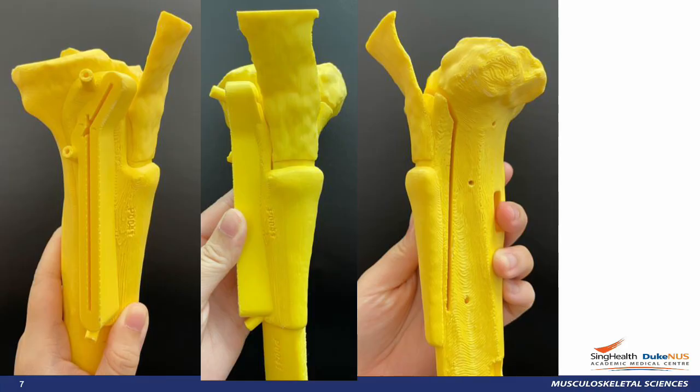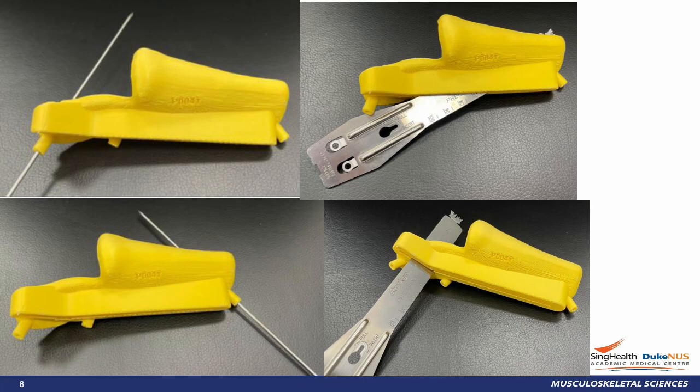After discussion and review within the team, a physical prototype of the jig and 3D model of the patient's tibia, fibula, and section of the patella tendon is printed out. During the final planning session, a go and no-go check should be performed for the attachment points and cutting slots with the K-wire and a saw blade. The final jig is then printed and sent for sterilization.